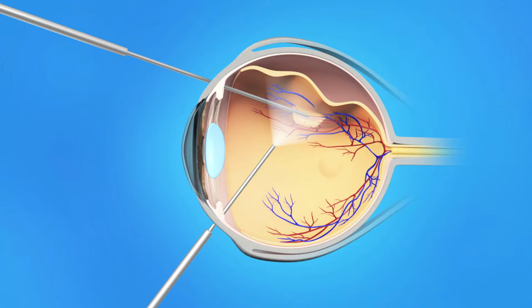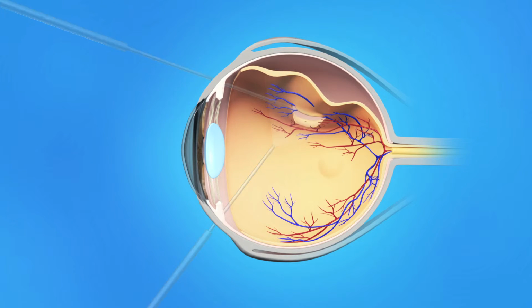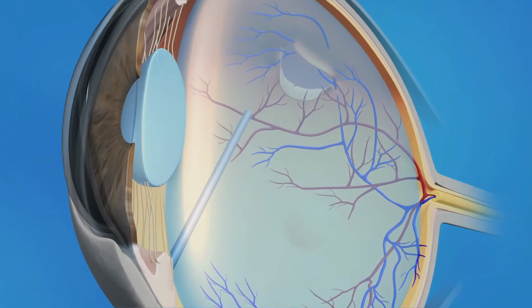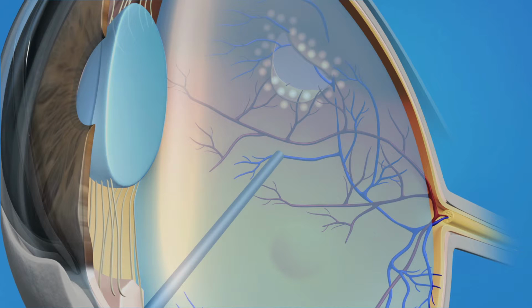Your ophthalmologist will repair your retina with vitrectomy and a scleral buckle. This procedure is done in an operating room, and your eye surgeon will use either a local or general anesthesia. During a vitrectomy, your ophthalmologist makes a tiny incision in the sclera, or white of the eye. A small instrument is placed into the eye to remove the vitreous gel. Once the vitreous is removed, your surgeon will inject a gas or silicone oil bubble into the eye. This pushes the retina back against the wall of the eye. The tears and weak areas of the retina are then sealed with either a freezing probe or laser treatment.